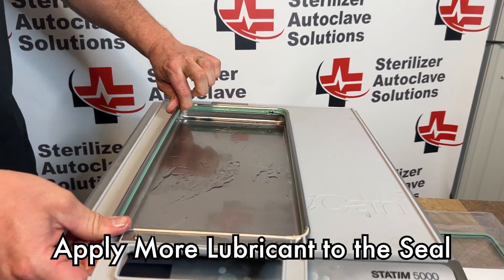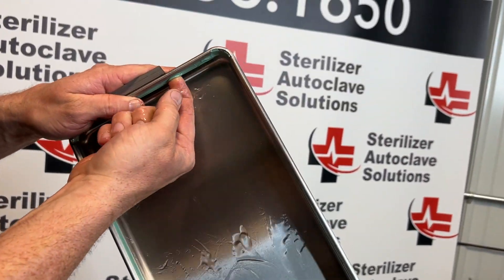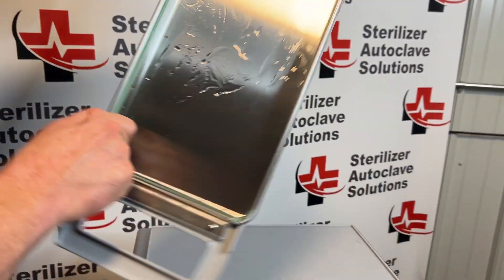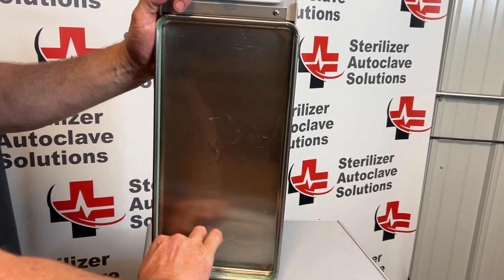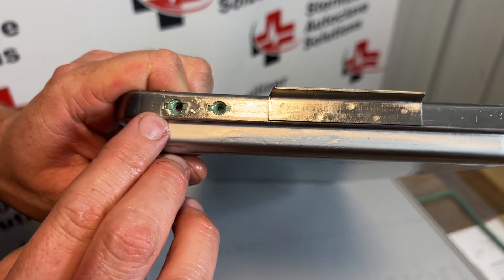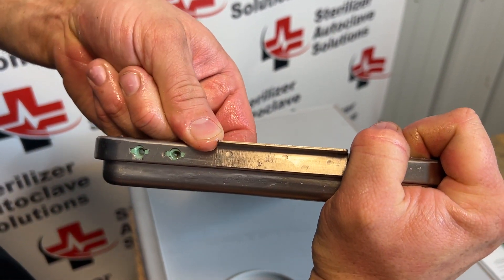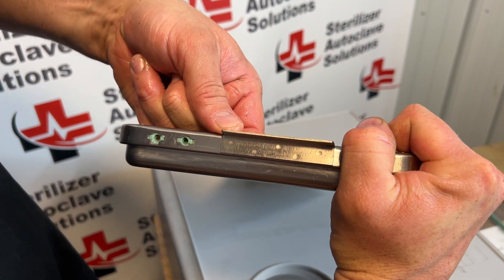Once that is all the way in, re-lubricate one of your fingers and put it right between the grooves of that seal. Pressing in and up, run your finger all the way around the seal and you will feel it set into place. We want to inspect and make sure our seal is centered — those square blocks should be directly in the center. Slide it over by putting your finger back in that groove, pressing in and pushing in the direction you want it to go.